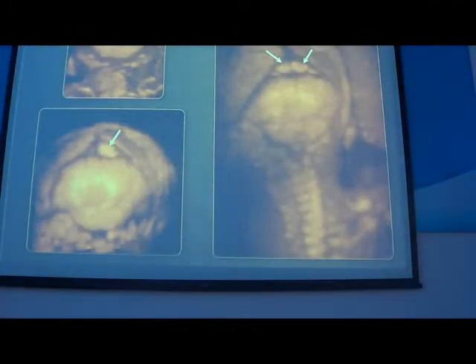This is a posterior view of the skull with a Wormian bone on the posterior fontanelle.